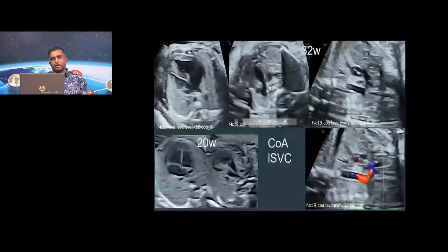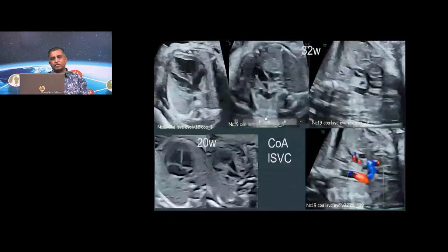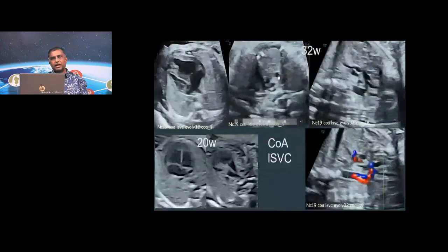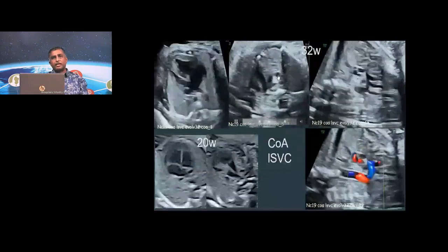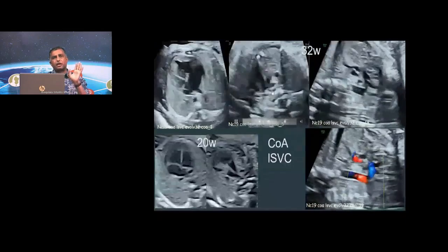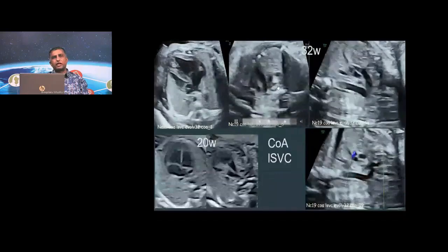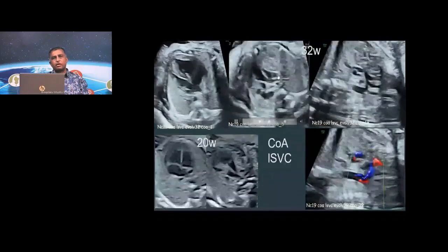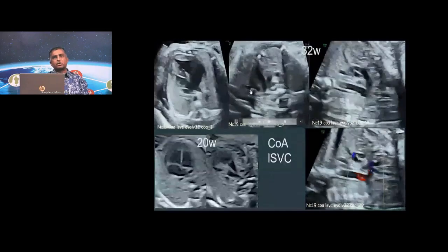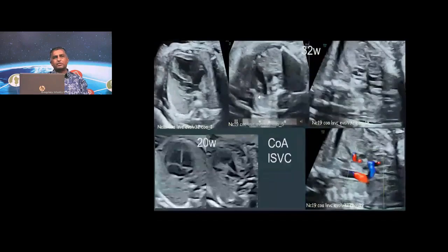This is the pulmonary artery, this is the left side, this is the right side. You see the pulmonary artery, you see the aorta, that's the SVC, the right-sided SVC. You find that the aorta is much smaller than the pulmonary artery. It should be only slightly smaller. Here it is much smaller. It's almost the size of the SVC. It should normally be larger than the SVC. And there's also a fourth vessel over here, and that's the left SVC, the LSVC.